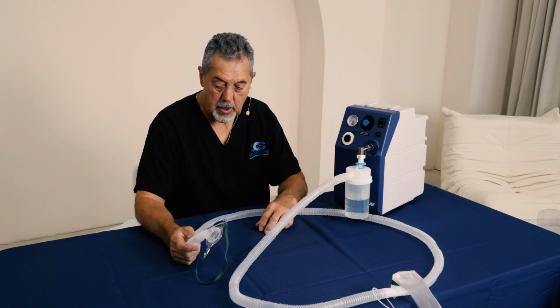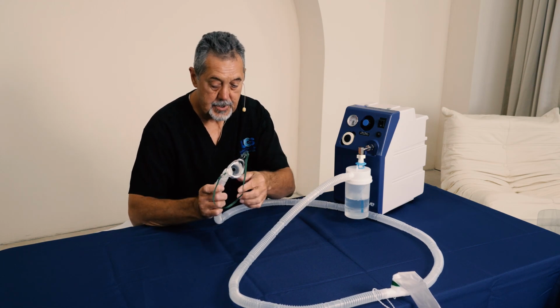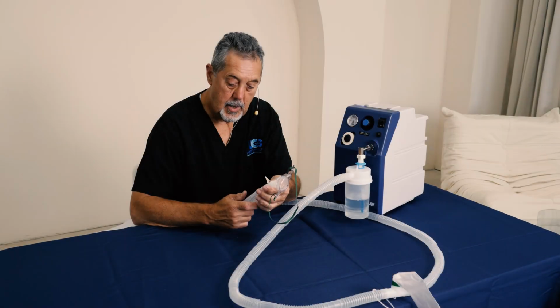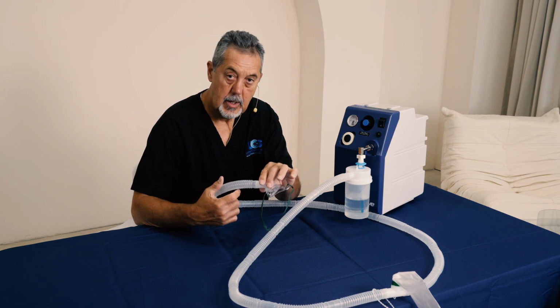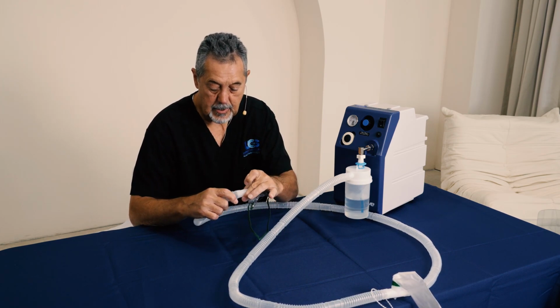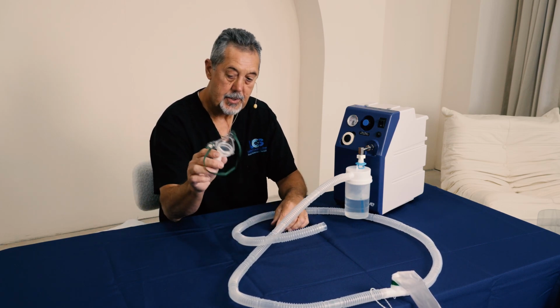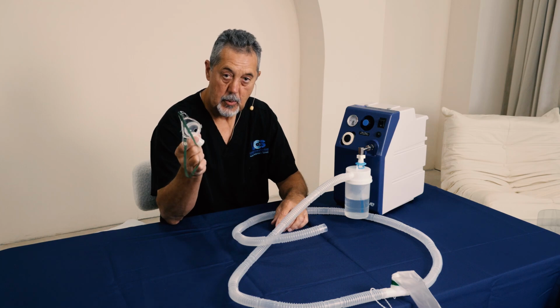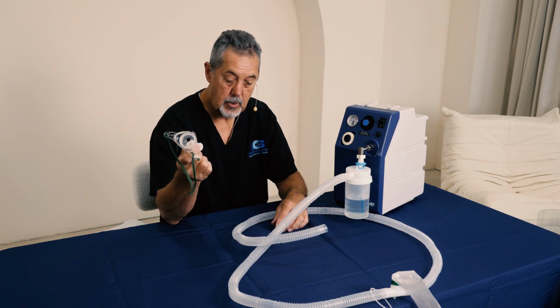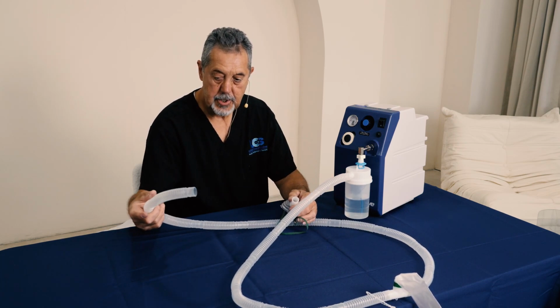If the insurance company, whichever insurance company you're dealing with, or your provider only sends you, let's say, 2 masks per month, then you only want to swap them out once you get them. So if you get 2 a month, you swap it out every 2 weeks. My recommendation is if you use this on a daily basis, that you take this and you wash it in soapy water every day, because it's going to get dirty quickly. Okay? The rest of this, at least once a week, change it out.